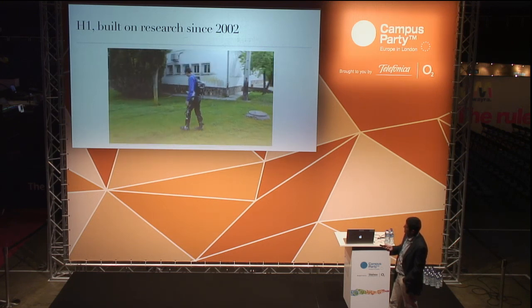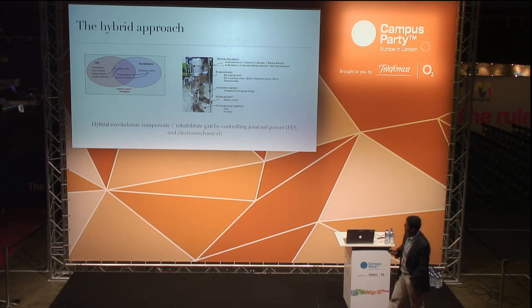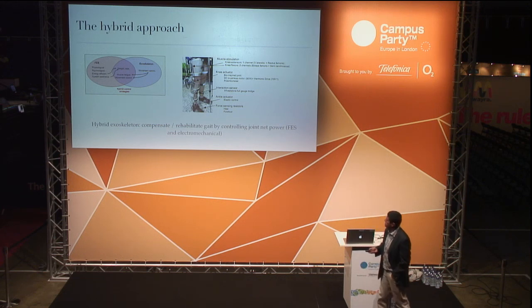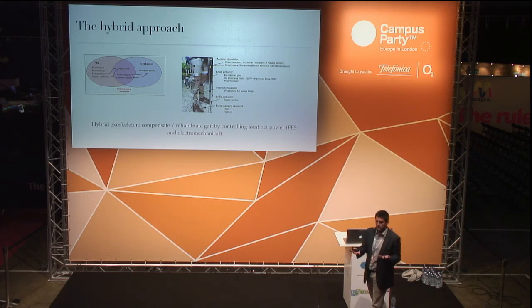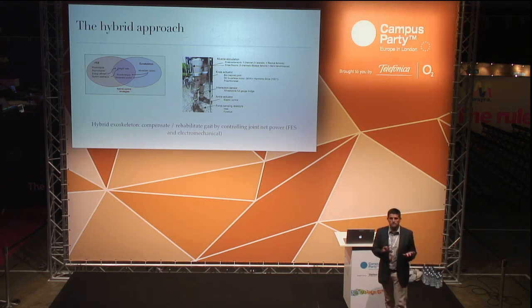This is another video, but I will skip this and go directly to the other videos because maybe they are more informative for you. So far, the presentation of the exoskeleton; we combine this technology with other technologies, as I said before. In particular, we combine it with functional electrical stimulation, and this is a setup where we have both systems. So we have the exoskeleton that you see here, the structure here, and then you see a number of electrodes in different muscles. So this is an application where we combine both technologies, so we assist the patients either with the exoskeleton or with the functional stimulation system, depending on the level of muscle fatigue that is being developed while walking.